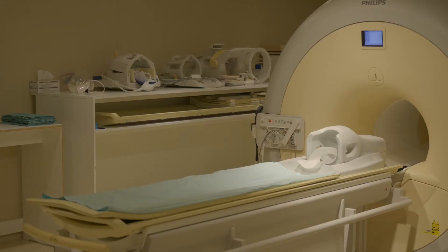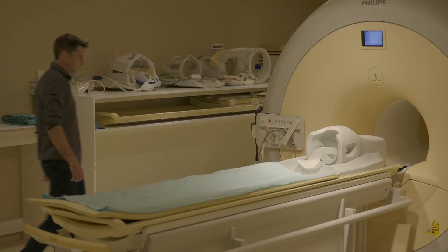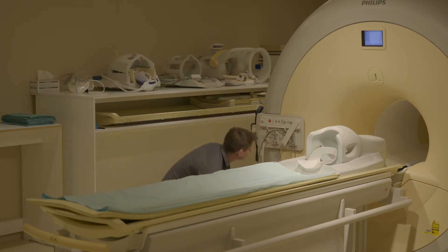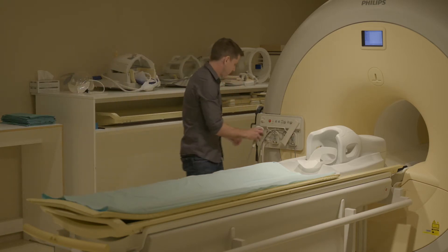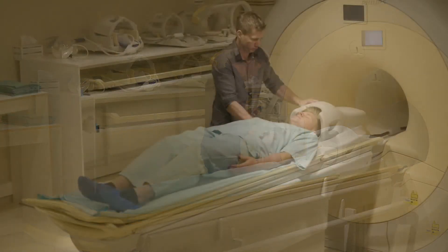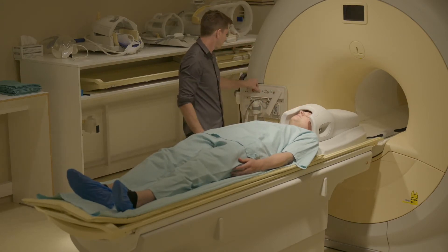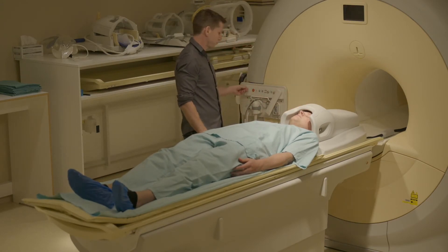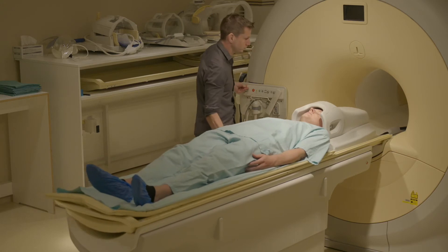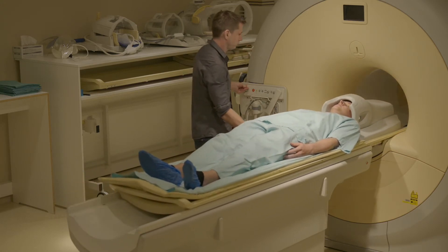Using the NeuroCam to acquire your neuroimaging datasets is simple. Connect the imaging receiver to the scanner via the system connector ports and field sensing probes to the scope acquisition system. Patient handling is comparable to standard MR receive coils.